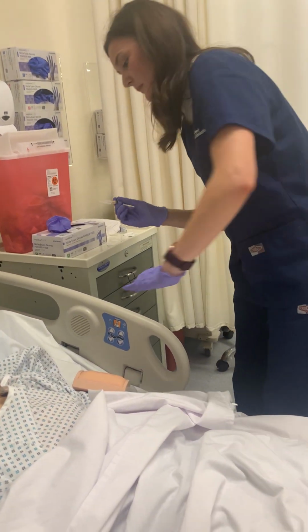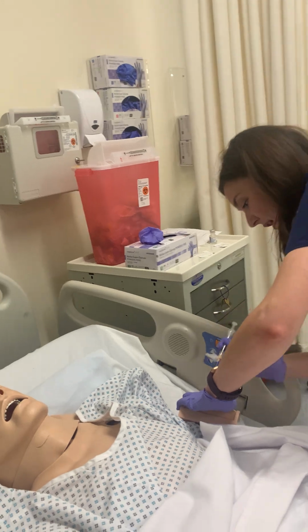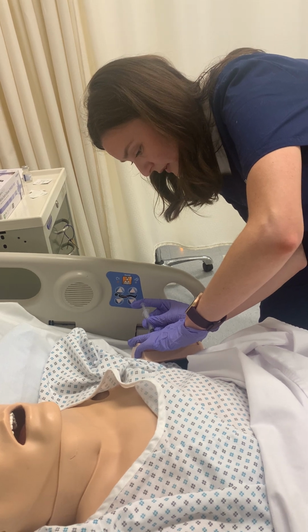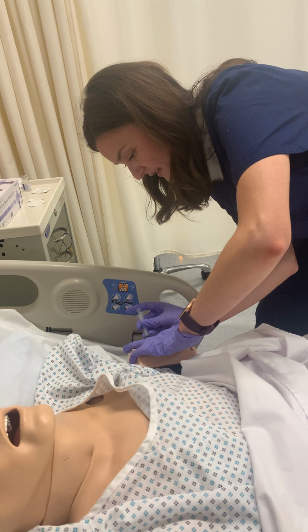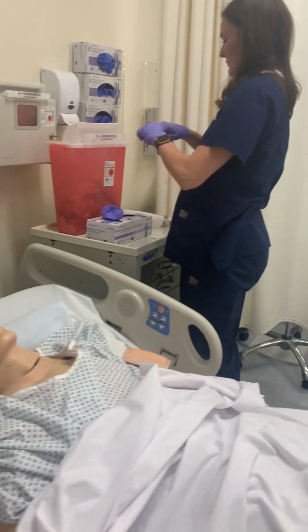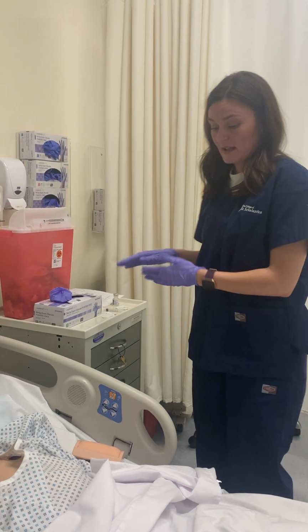Okay, so I would do 3 finger lengths down from the acromion process and pull the skin taut, and I'm going to go in like a dart. Here we go, 90 degrees. In we go. And I'm just going to insert that. I have to back it out a little bit so the liquid injects. Can pull that out. Clip this, and I would just drop the whole thing in here. But for the lab purpose, I'm going to keep the syringe. We're going to keep that.